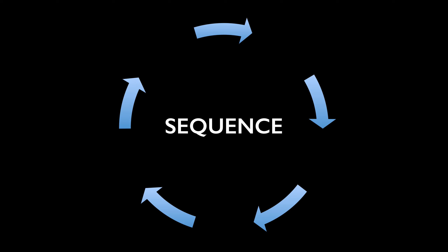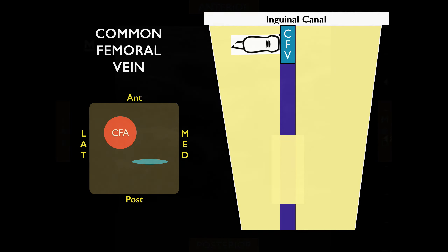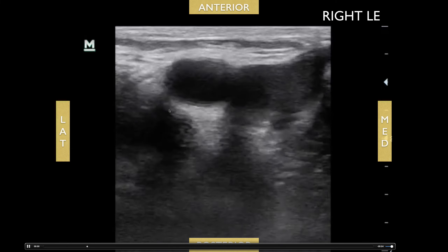For the scanning sequence, I like to go proximal to distal. Starting at the inguinal canal, right in the middle, locate the common femoral artery and common femoral vein. The common femoral vein is medial and the common femoral artery is lateral. Compress and you should see it fully compressible. Here's an example: the common femoral vein and common femoral artery, with the vein fully compressible.